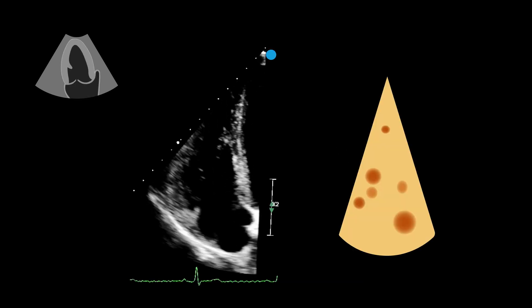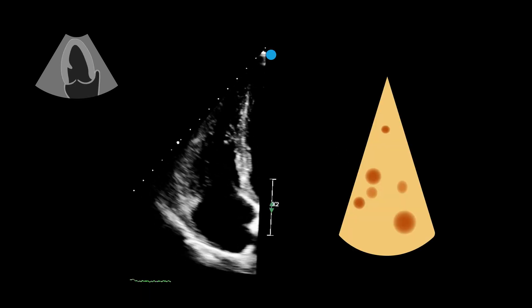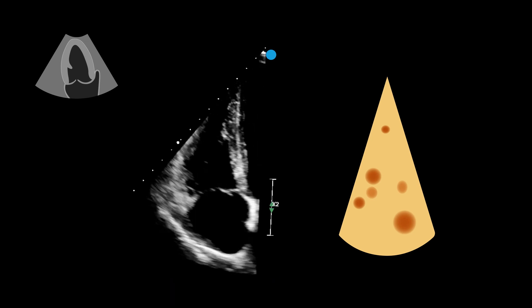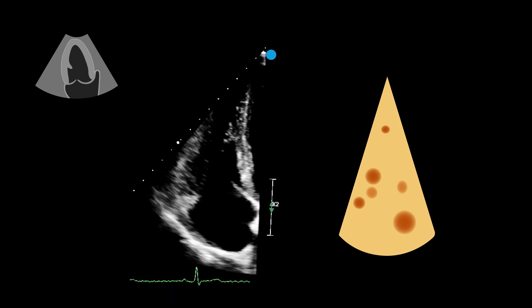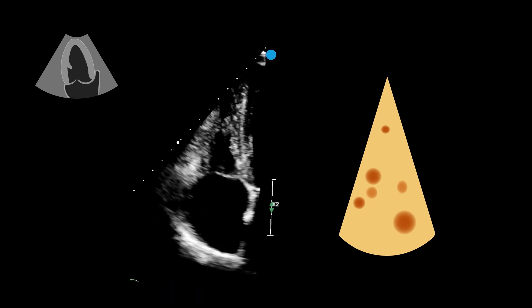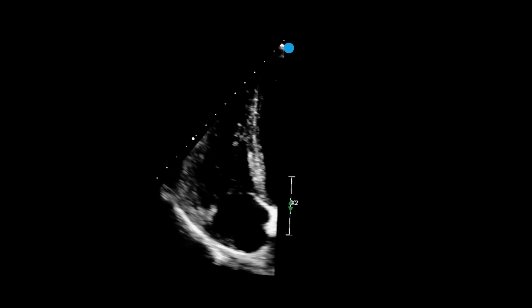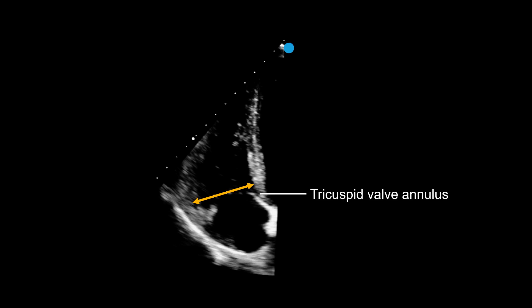Now let's look at the apical view. The right ventricle, in this view, resembles a triangular wedge of cheese. Here, we can take three measurements referred to as dimensions. Dimension one, the base, or basal diameter, is taken just above the tricuspid valve annulus, where the right ventricle is at its widest.